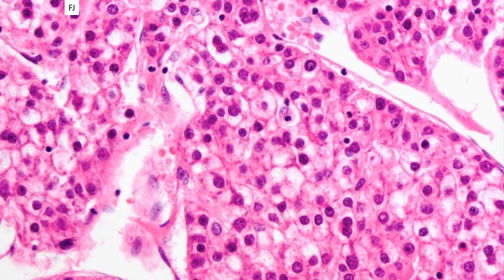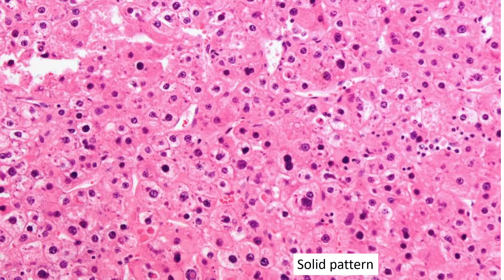As a baseline, this is what a classic hepatocellular carcinoma looks like: round nuclei, abundant, slightly eosinophilic to pale cytoplasm, often distinct cytoplasmic membranes. So that's our baseline. Pattern number two is a solid pattern — fairly common — with no trabeculae, or no easily discernible trabecular architecture.